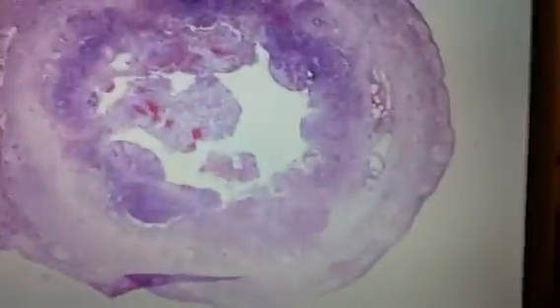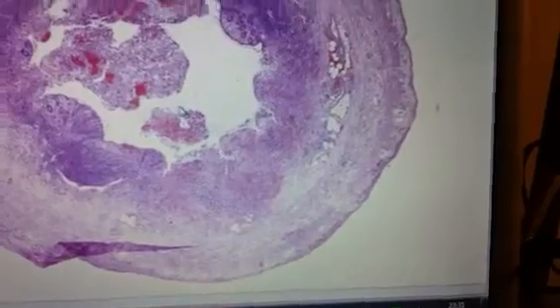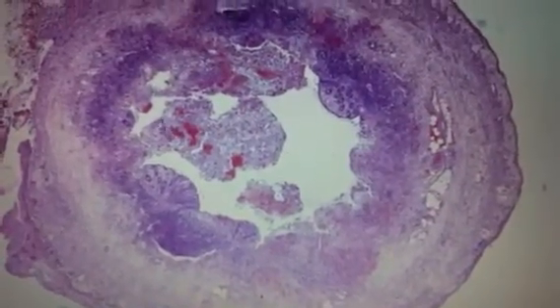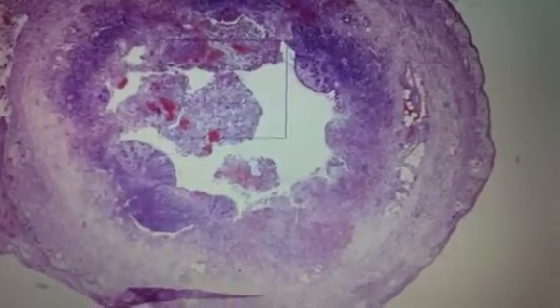You see this pus inside here, and then you see the lymph nodes are enlarged. There's not much to see. It's acute, so they don't have much time to adapt, but this is what you see in the middle. I don't know if you can see anything else. I don't guess so. I don't want to spend too much time on it. Okay, that was the acute appendicitis.